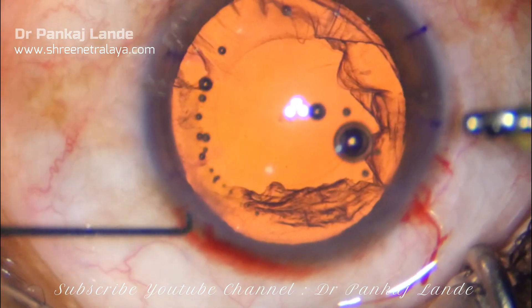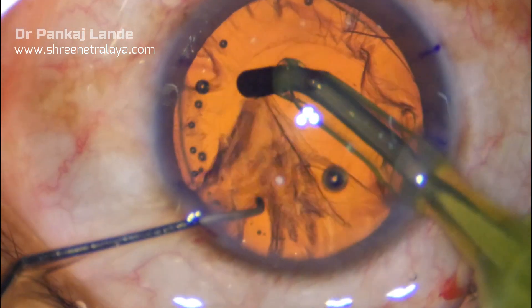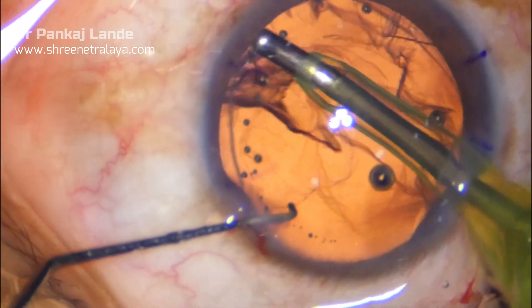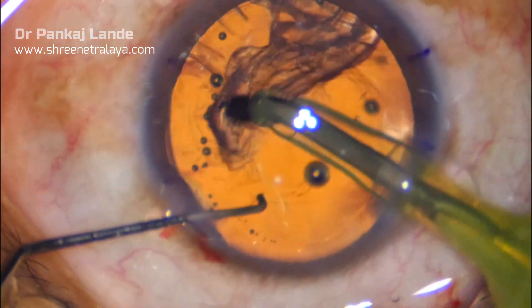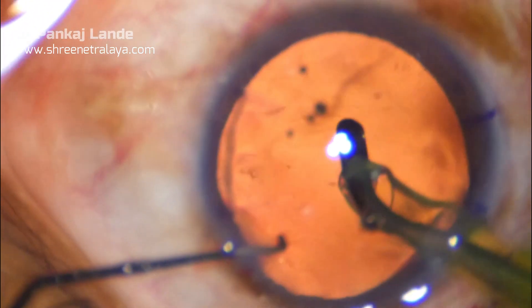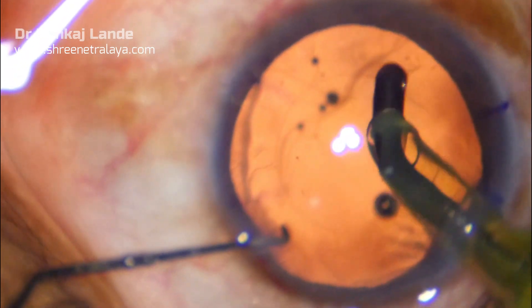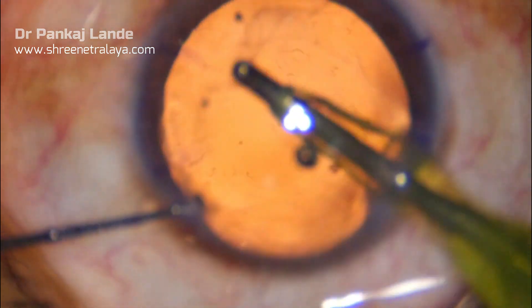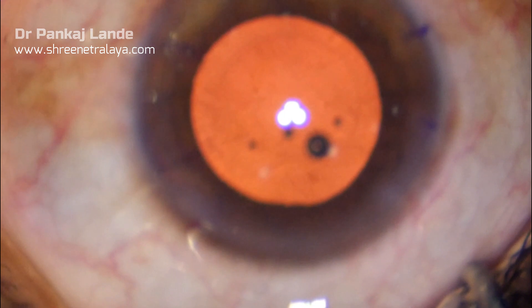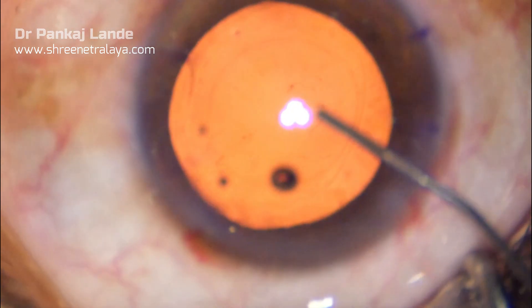The irrigation aspiration is done with a coaxial IA through the main port only. Start with sub-incisional cortex first, followed by remaining cortex. Do not try to pull each and every fiber in the center. Rather, make a sweeping movement — hold a larger chunk in the port and then pull to the center so that you will have a good hold and cortical cleanup will be a matter of seconds.